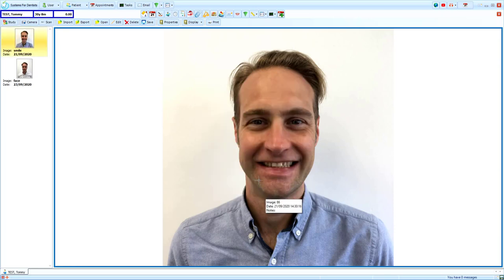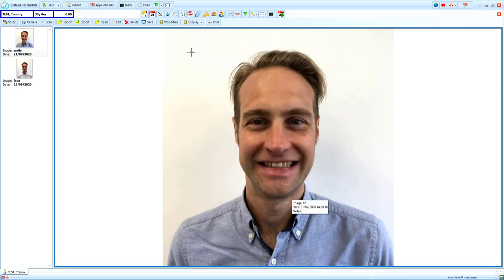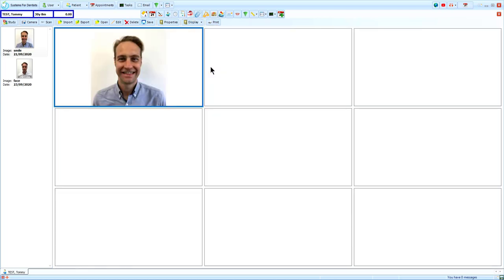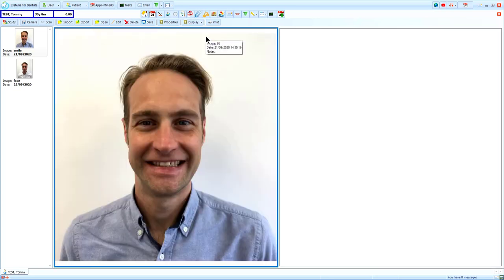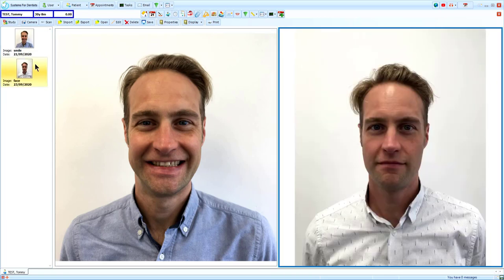The properties can also be accessed by right-clicking on the image and selecting Properties. Display gives you the choice of how many images you want to view at once, and allows you to view up to nine images in a 3x3 grid. For this example, I will choose to view two images side-by-side. By selecting the free image pane, then double-clicking the image in the left-hand column, I am able to compare these images.